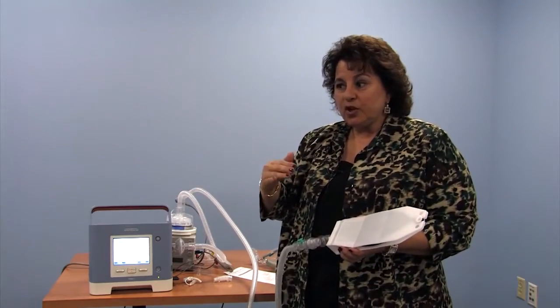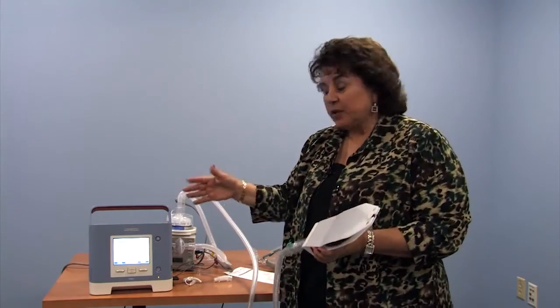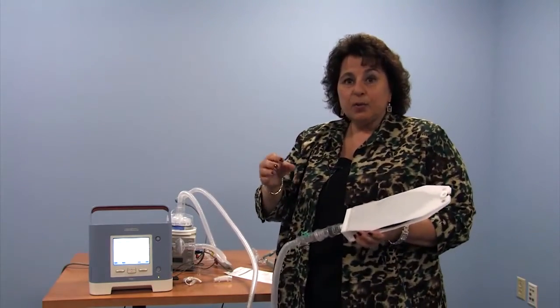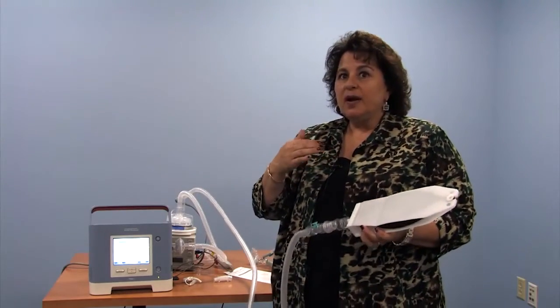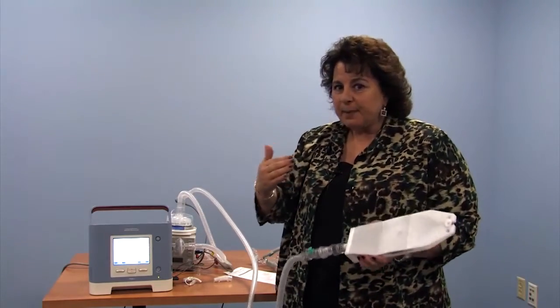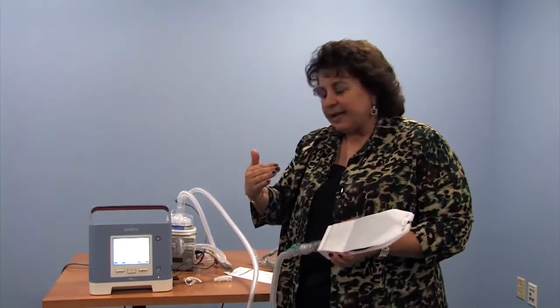Depending on when you go in and out of a hospital facility, they may use a different device than the Trilogy, and it may do the support differently. So if you were to come to Children's Hospital and go onto a ventilator with a tracheostomy tube, they would call it pressure support, and the numbers you give them might make it a little confusing. So try to remember that it's up to 15 and down to 5.